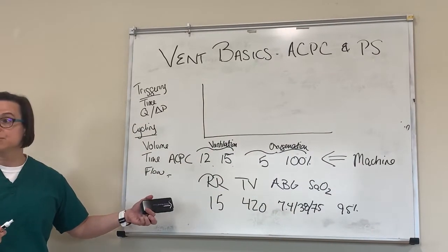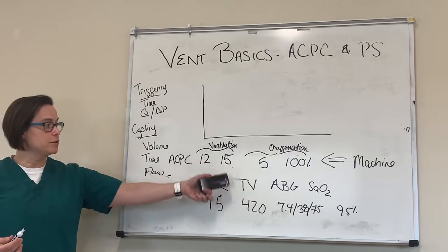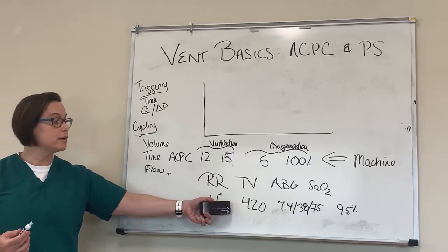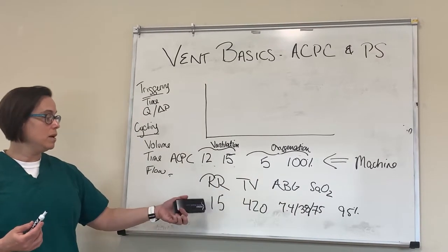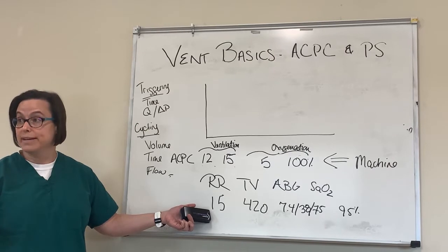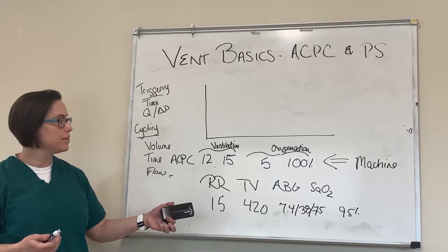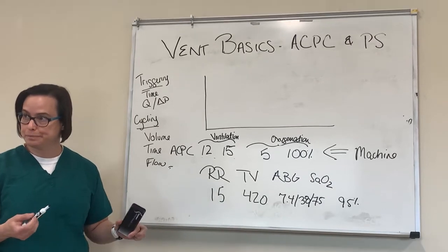I know how that patient's doing. I know they have reasonable lung compliance. With only a pressure of 15, they're generating a pretty good tidal volume. I know they're oxygenating well, they're ventilating well, they're breathing over the ventilator, so their own brainstem's intact, they're able to generate their own breaths. So that gives me all that information just based on that, okay?